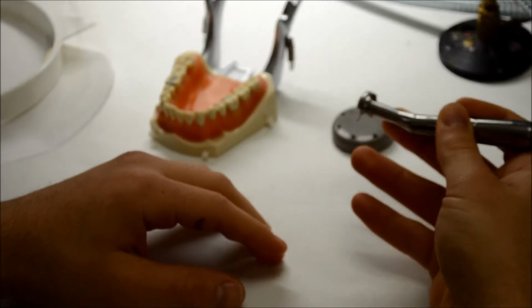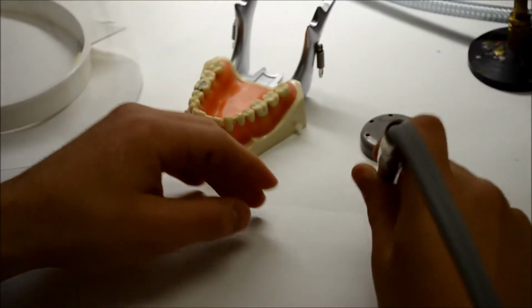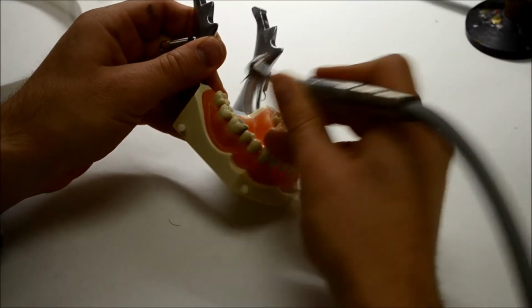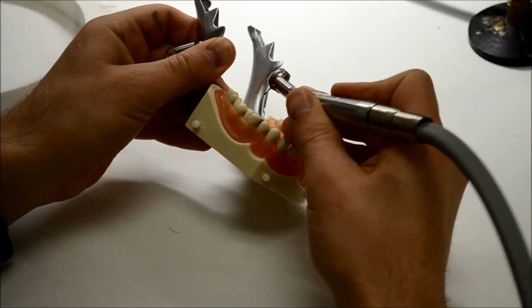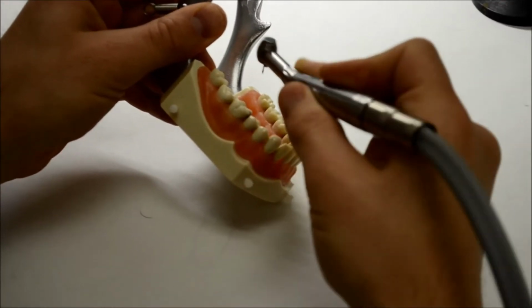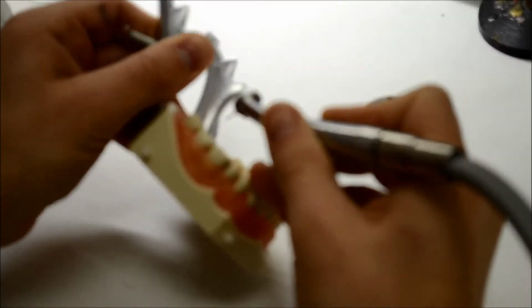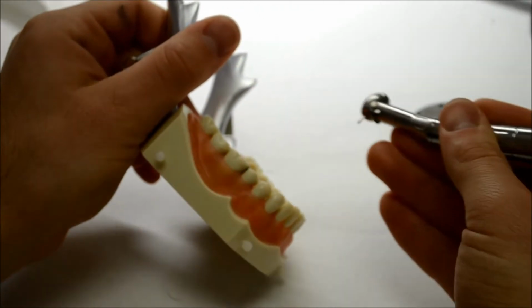Another really important thing to do while drilling is to have a fulcrum. These other two fingers can be used to stabilize your burr while drilling. So for example, if I'm drilling back here on these teeth, I would put these fingers back here on the front teeth, so that when I'm drilling, I'm not drilling freehand and being really sloppy. So I have these fingers over here when you're drilling over here, and it'll be much better for you.